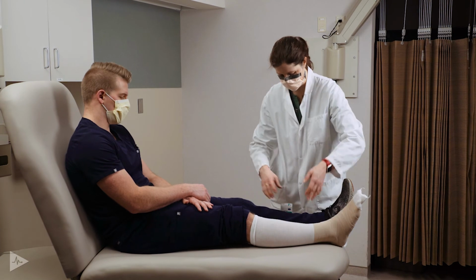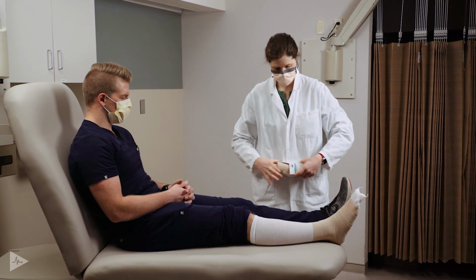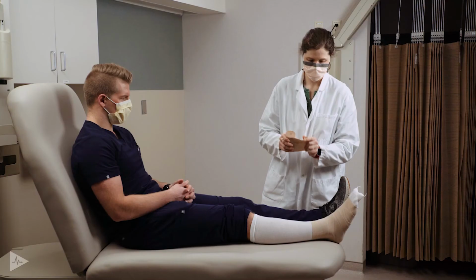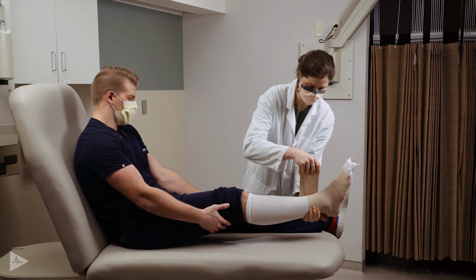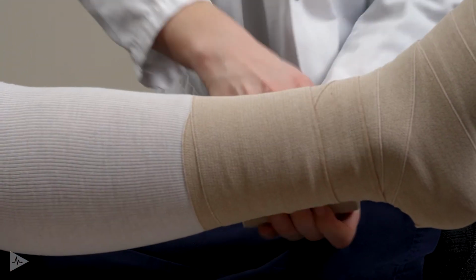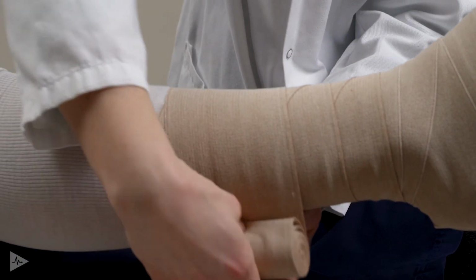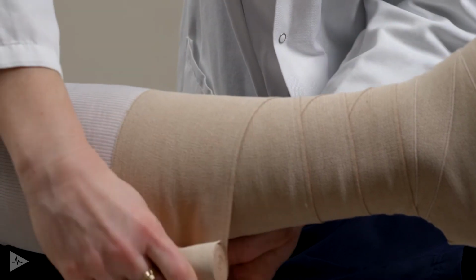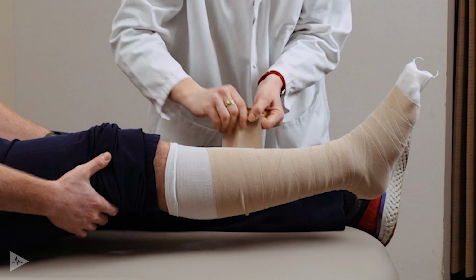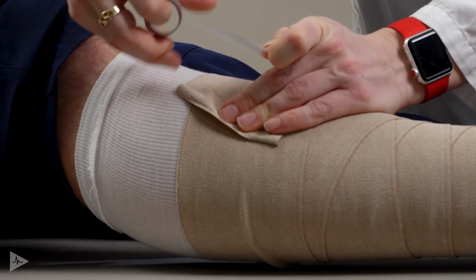Then to continue the compression up the leg, we will transition to a wider low stretch wrap. So this will be a 10-centimeter wrap. Again, want to start with that leading edge and continue that crisscross pattern up the leg. The other option would be a spiral wrap, and that will just kind of look like a barbershop pole, continuing up the leg. And again, we will tape that final edge in place.